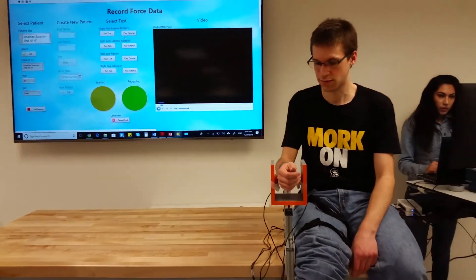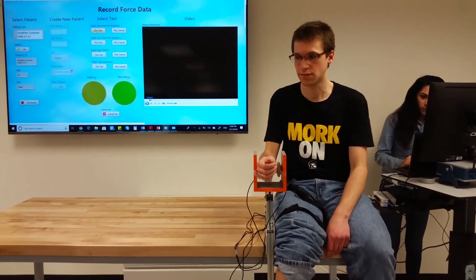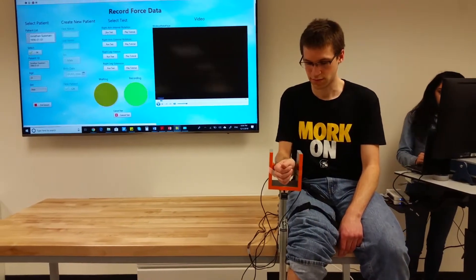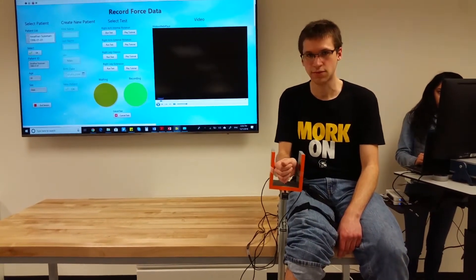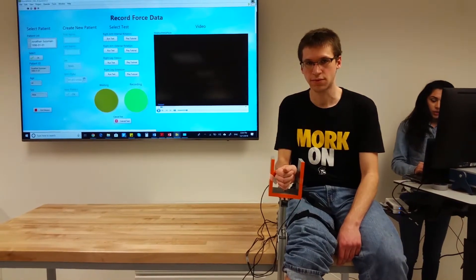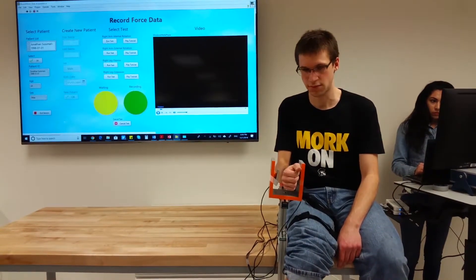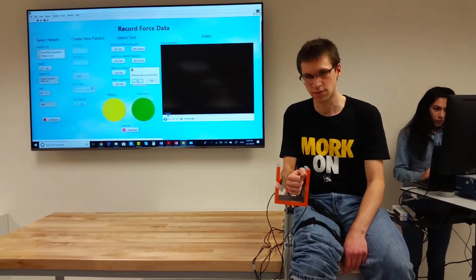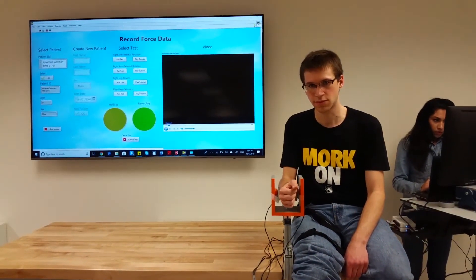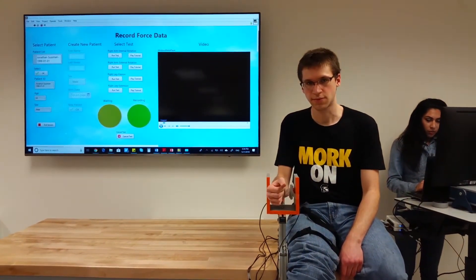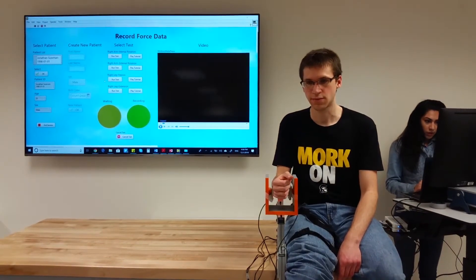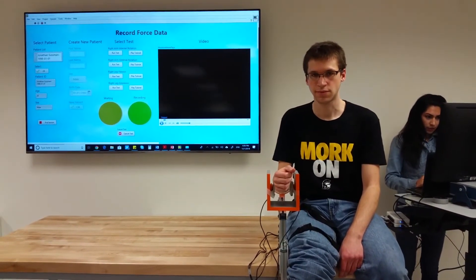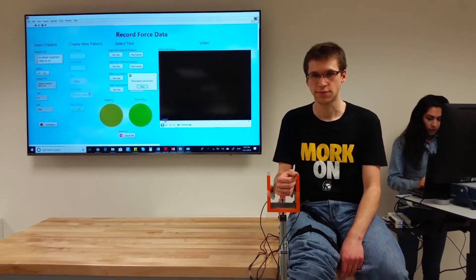After watching the tutorial, the patient waits for the yellow light, indicating that the test is waiting, and then presses as hard as possible for five seconds. The green light shows that the test has started. Once the green light has turned off, the technician saves the trial and can complete the remaining tests. Once the technician completes the test, the technician can end the session, the patient can be dismissed, and the technician will be redirected to the main launcher.